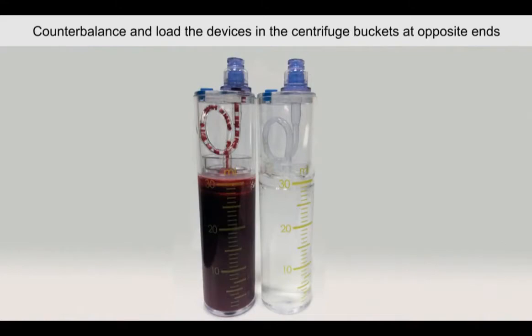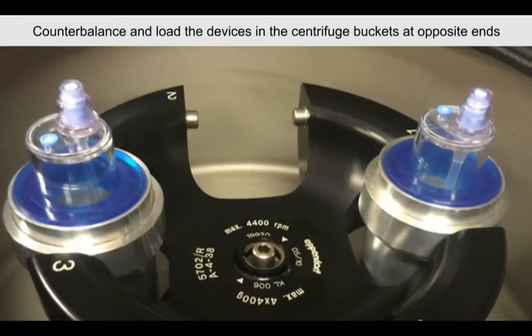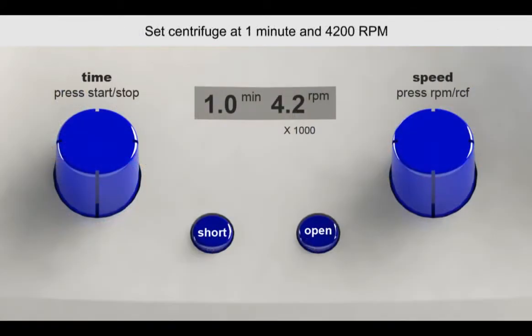Counterbalance with the provided counterbalance device, then load the devices into the centrifuge bucket at opposite ends. Set the centrifuge at 1 minute and 4200 RPMs. Close the lid and press start.